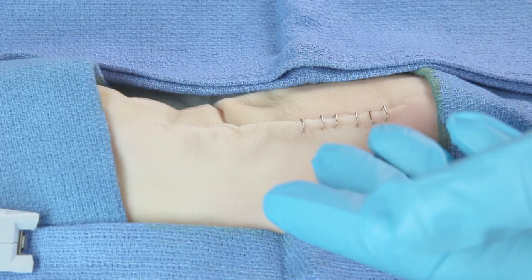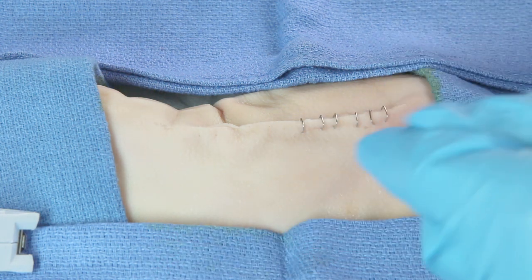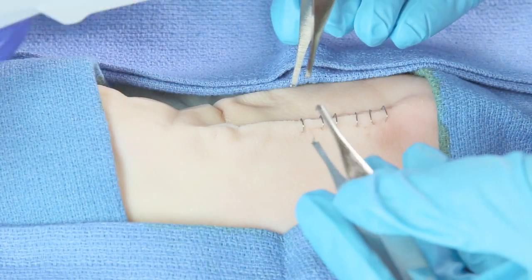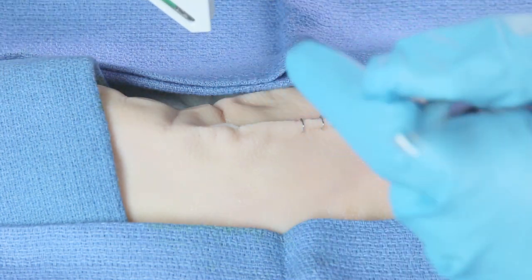Here you see that we're using my 95-year-old grandma again for our demonstration — again, just kidding. It's a pig's foot, a great template to practice on. The assistant is going to use Adson forceps, the same instrument I showed you to help with suture procedures, but this time they're using two. You'll hold one in each hand if you're the assistant, like you would a pen.